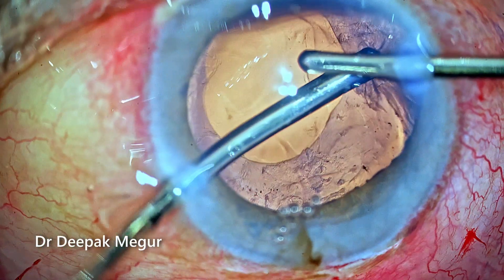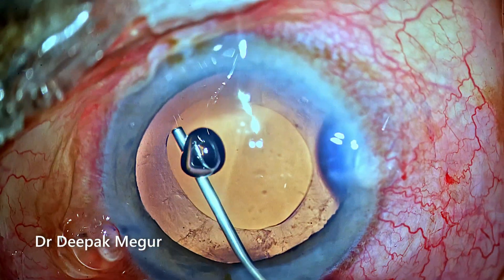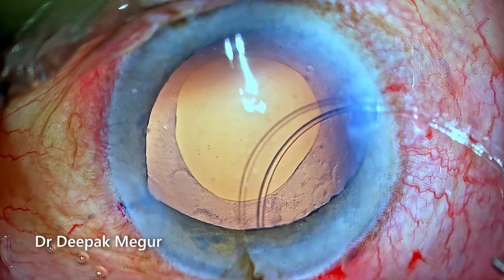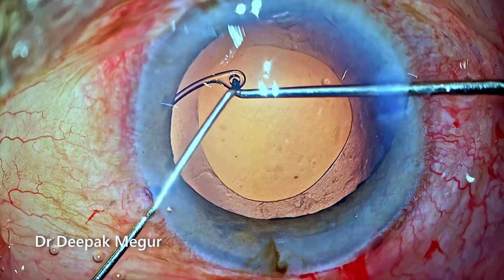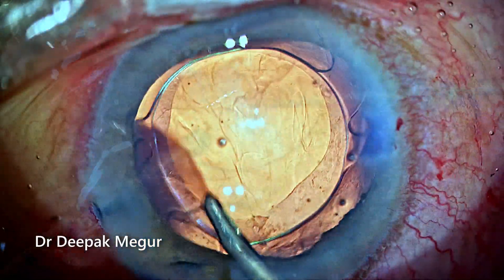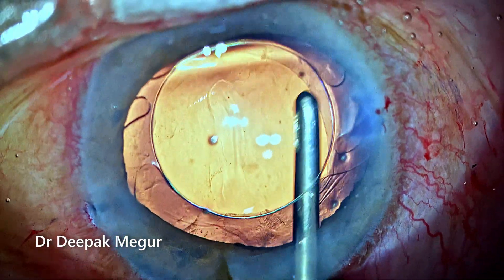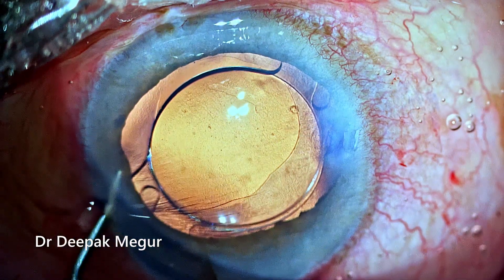The cortex is aspirated out. Before placing the lens, I always like to insert a CTR into this eye because these eyes have a compromised zonule, so I always prefer to have a ring inside. Then a hydrophilic single-piece intraocular lens is placed into the bag. The OVD is washed off, the side ports are hydrated, and the case is done.